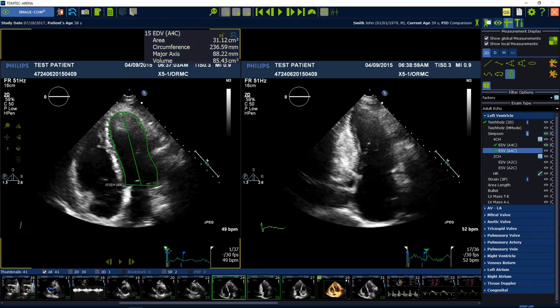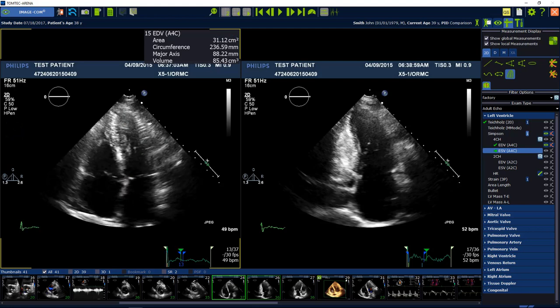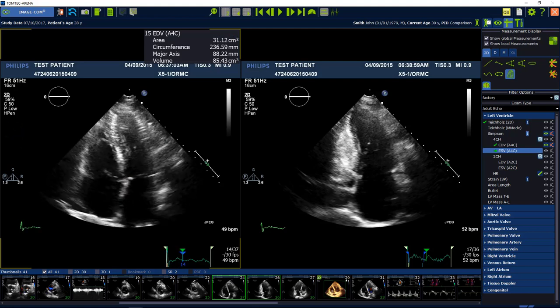Continue the procedure with the end systolic volume of the 4 chamber view, followed by the end diastolic and end systolic volume of the 2 chamber view.